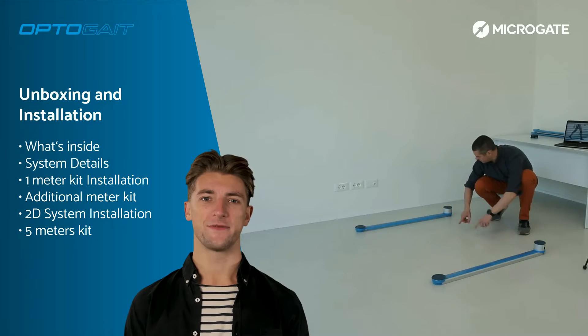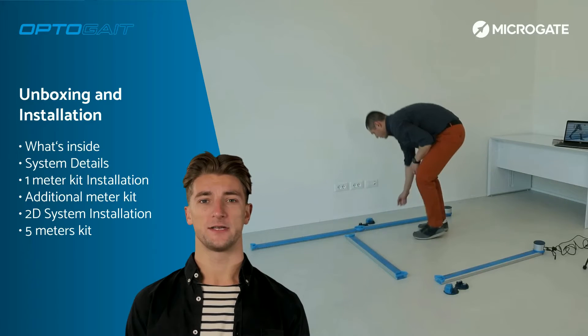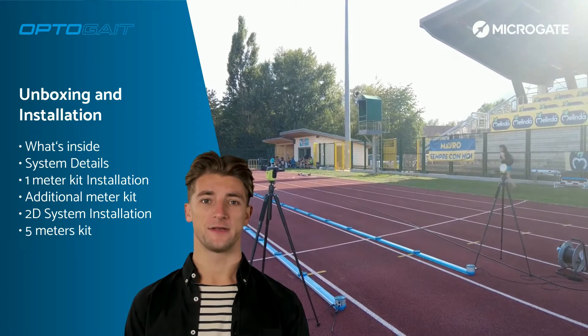We will also see the system in its various configurations, from the single meter to the 2D configuration, from the basic system with additional bars to pre-configured kits of 5 meters or more. Let's start.